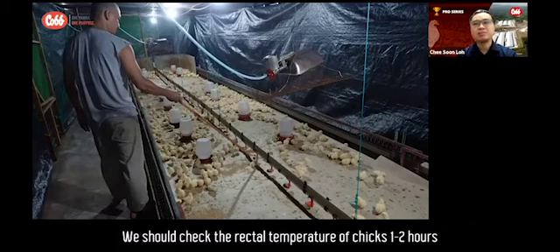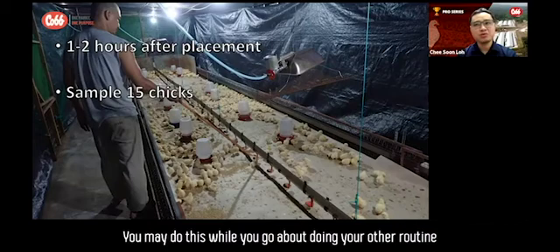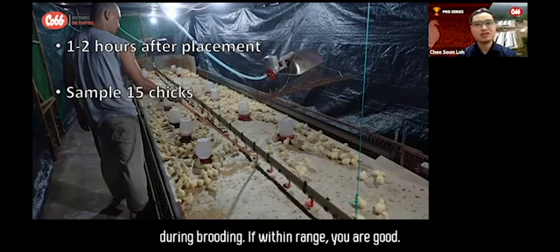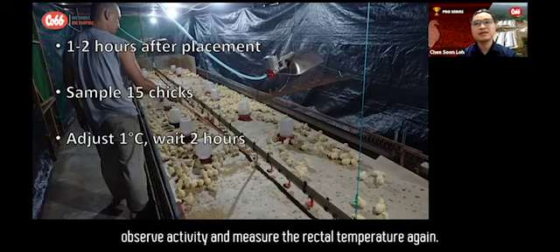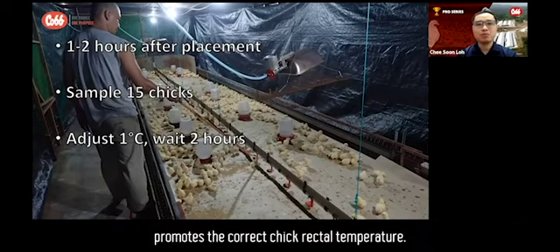We should check the rectal temperature of chicks one to two hours after their placement. Get a minimum of 15 chicks per house, evenly distributed. You may do this while going about your other routine tasks during brooding. If within range, you are good. If the rectal temperature is incorrect, adjust brooding temperature by one degree Celsius, wait two hours, observe activity, and measure the rectal temperature again. Repeat until you achieve the correct brooding condition that promotes the correct chick rectal temperature.